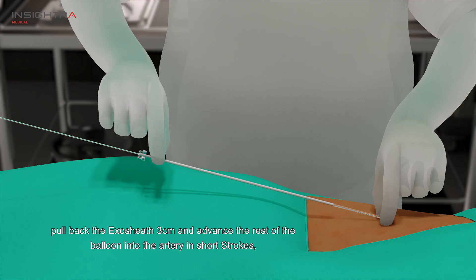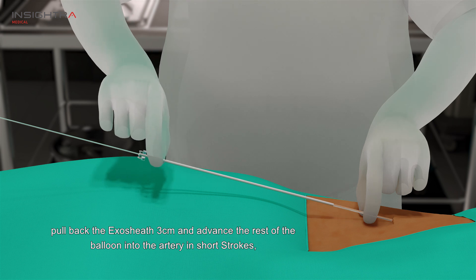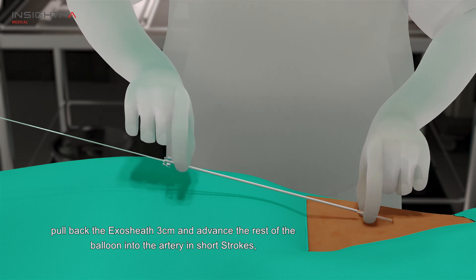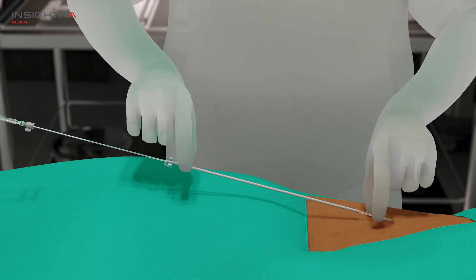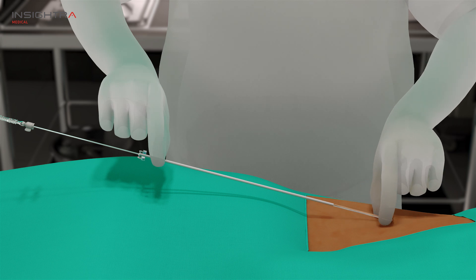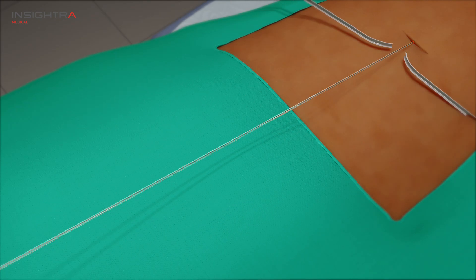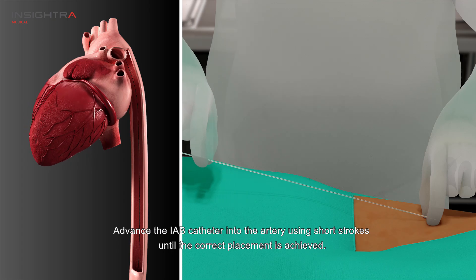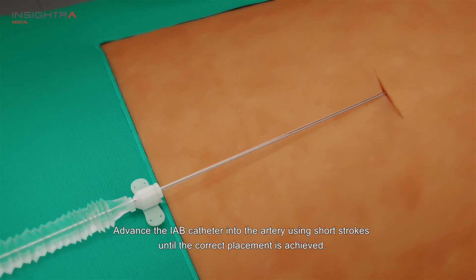As the balloon tip is inserted, pull back the exo-sheath 3cm and advance the rest of the balloon into the artery in short strokes. Advance the IAB catheter into the artery using short strokes until the correct placement is achieved.